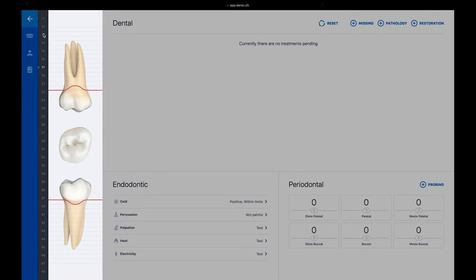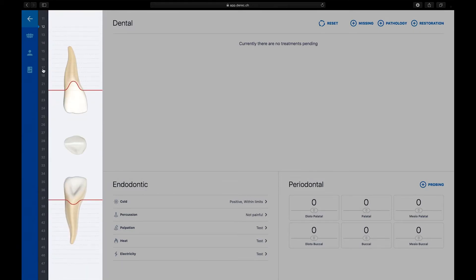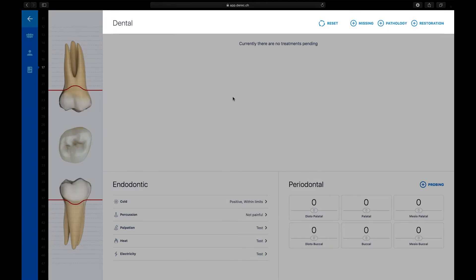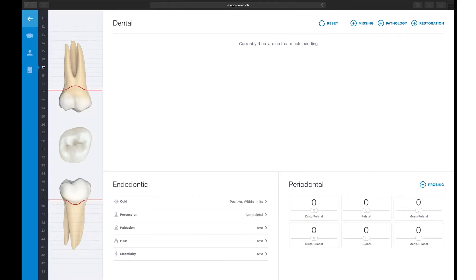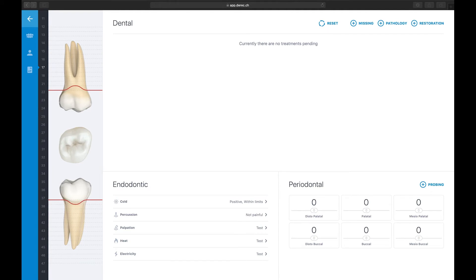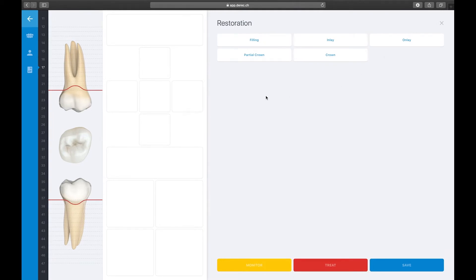On the left portion of the screen, you will find a tooth navigation bar for jumping from the current tooth to another one. To go to the next or previous tooth, you can also navigate by swiping up or down on the tooth graph. On the top portion of the screen, you will find buttons for adding pathologies and restorations to the tooth, or to mark the tooth as missing. The Reset button will reset and delete all previously entered data, so use this button carefully.